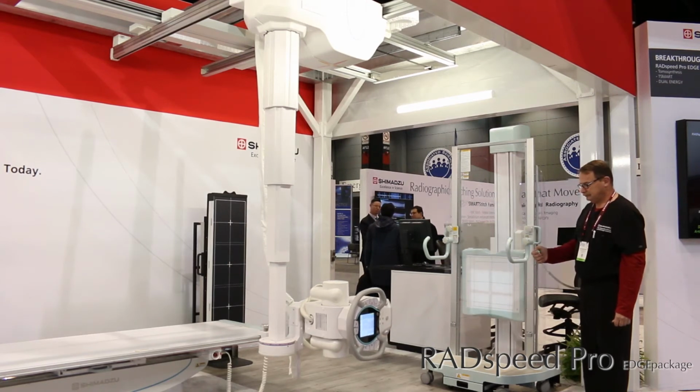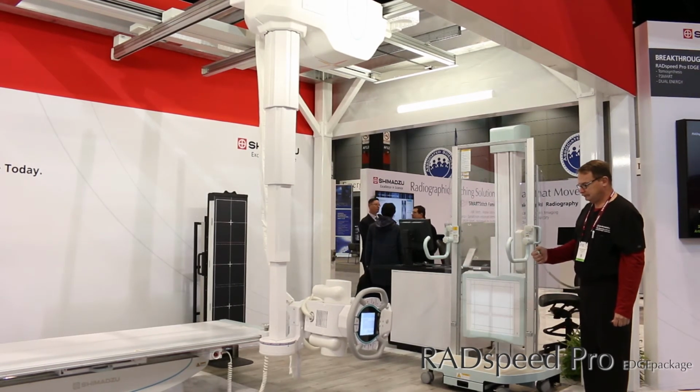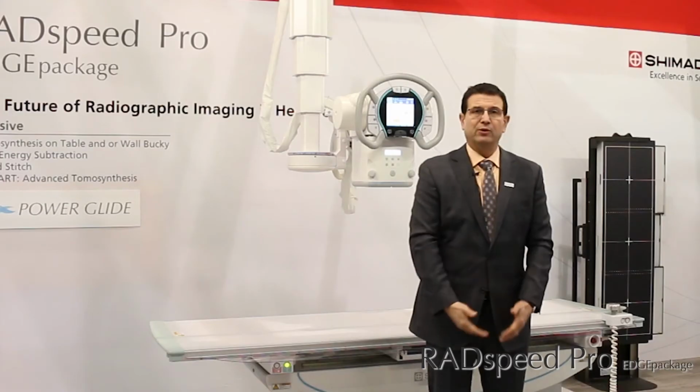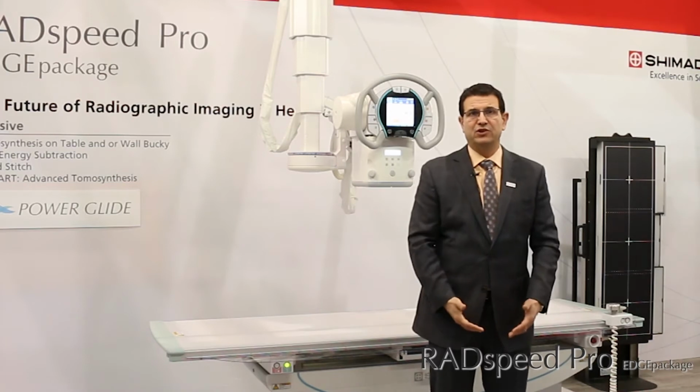Speed stitch is what goes to our wall bucky here. We position the tube to look at the wall stand. We're able to take 3 or 4 images to do long bone or long view imaging.